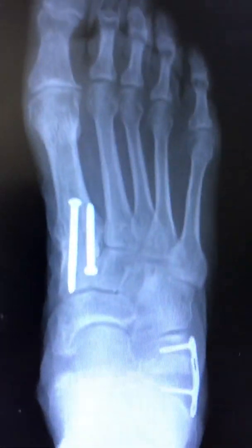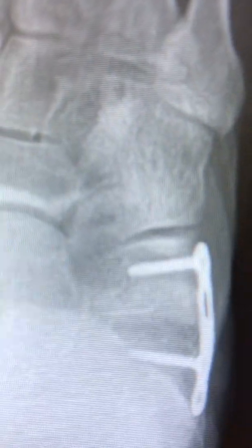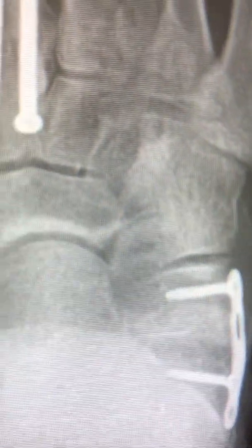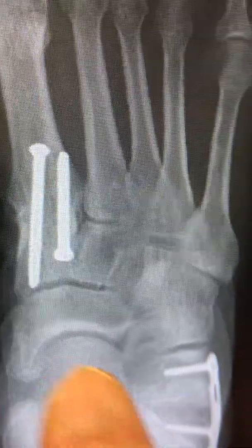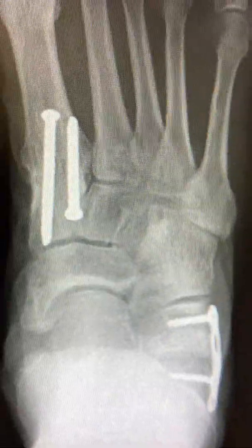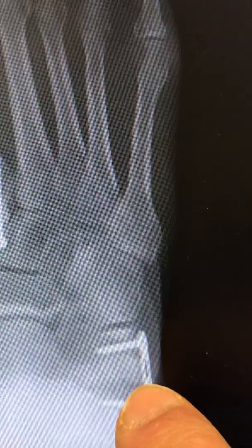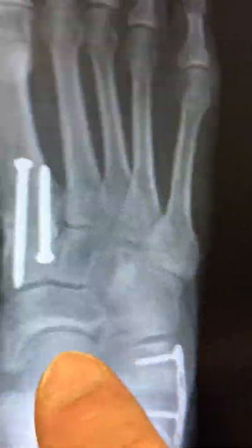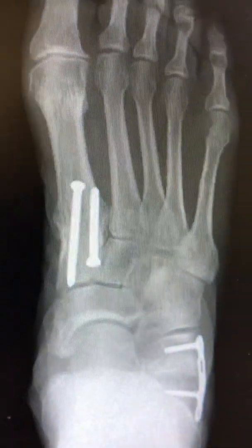When we look at the work that was done on him, we can see the graft and the Simline, which is right there — that's exactly where it should be. We can see the calcaneus and the cuboid line, which is straight. We can see the talus back in the socket, not escaping. And these are weight-bearing views, by the way.